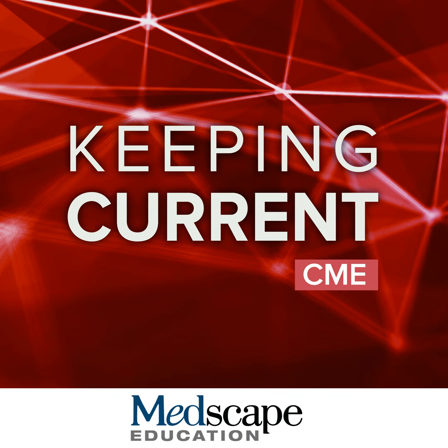So the Centiloid scale goes between 0 and 100. Patients who have a Centiloid over 30, that's pretty well established as correlating with established Alzheimer pathology. Now, patients with a Centiloid less than 10, if we aggregate multiple studies, that's generally negative.